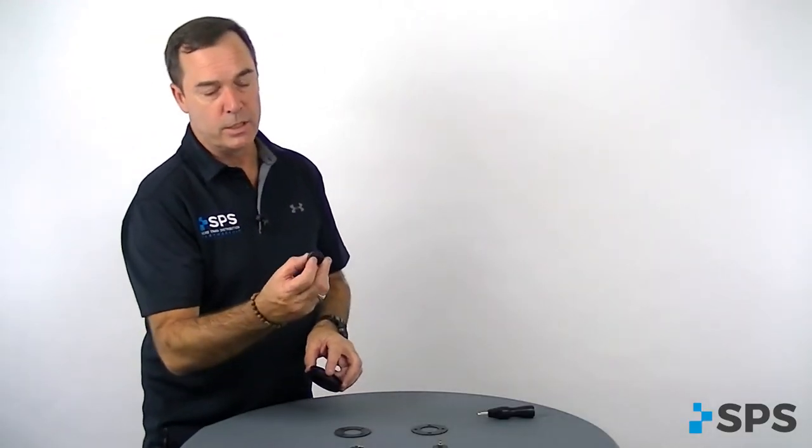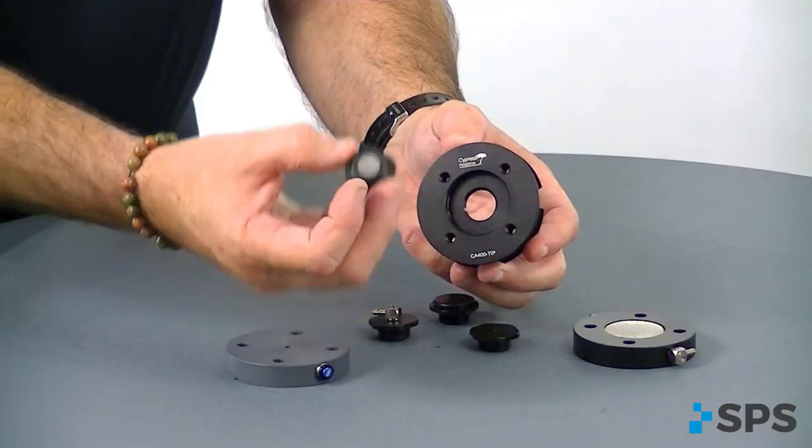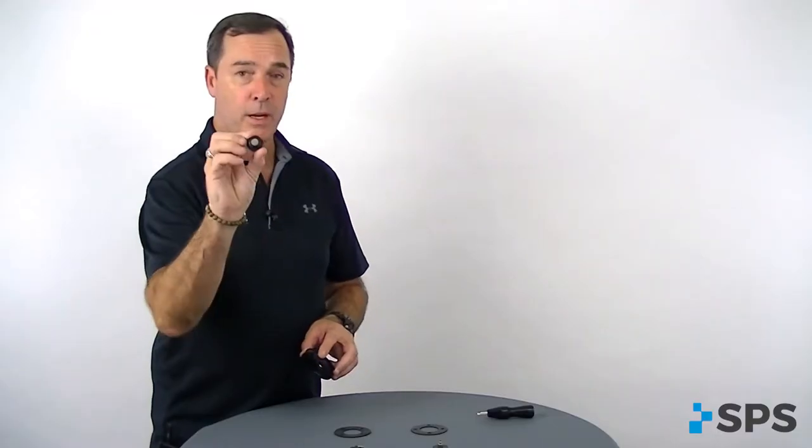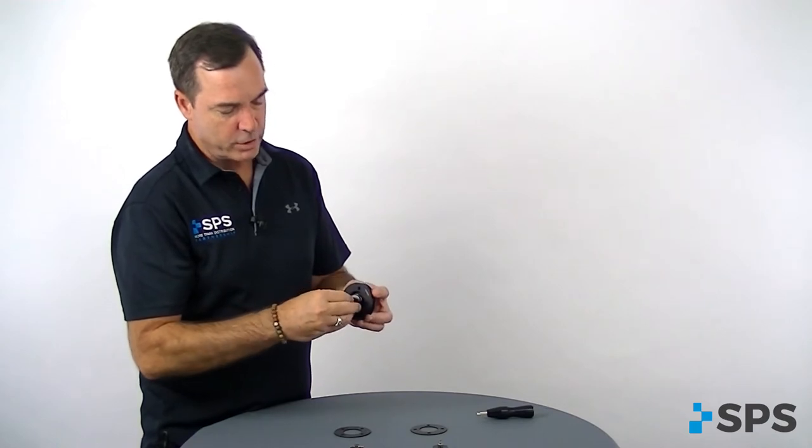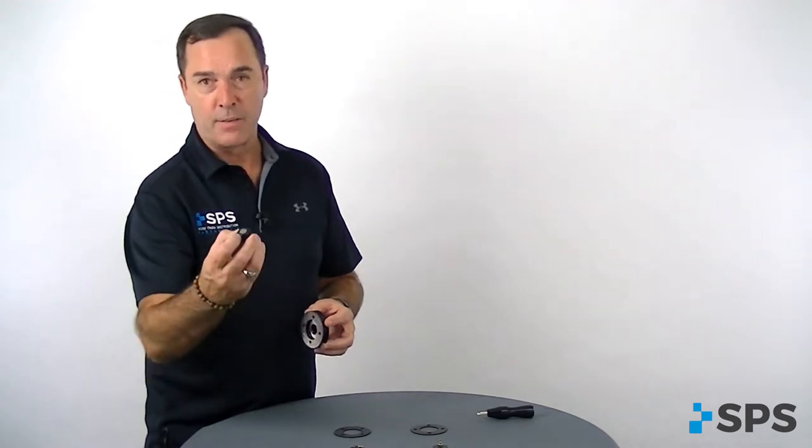The other insert is a one-way expulsion valve with a screen to prevent lint, dirt, and debris from going down in the valve. It will just screw in there and it does have an o-ring for sealing.